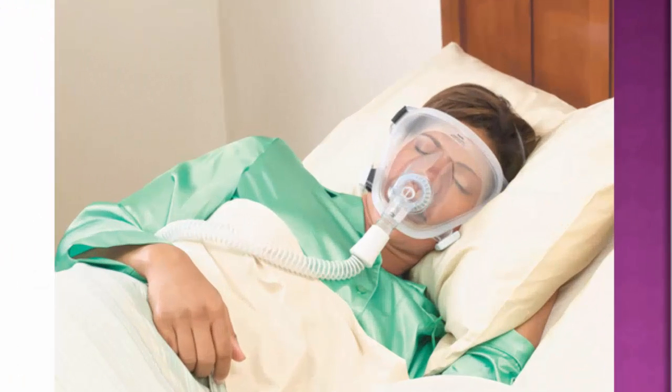On the right-hand side is figure 45-8. This is a total mask, and you see that it covers the whole face. Now, the problem with this one is it actually applies pressure to the eyes also, but there seems to be less claustrophobia with it also.